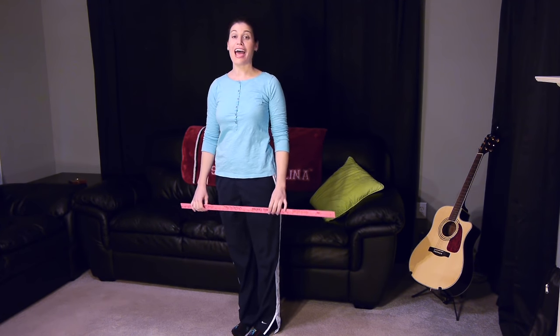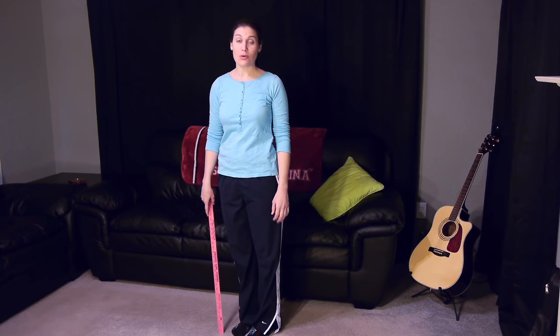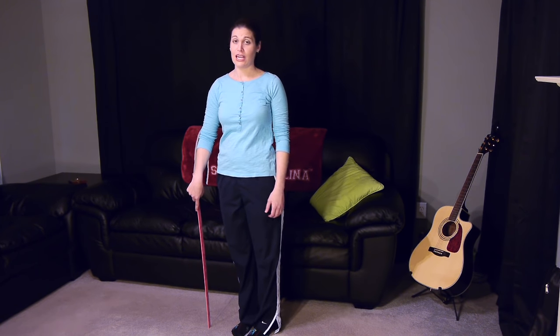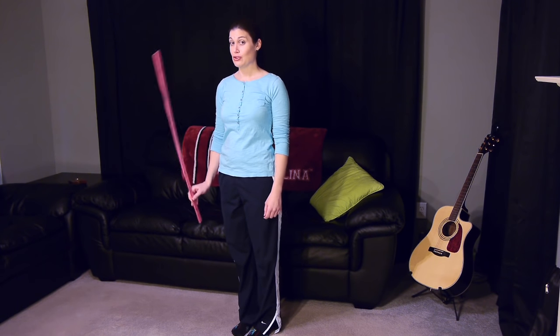Hey everybody, it's Dr. Jo, and today I'm going to talk to you about how to use a cane properly. You would think that such a simple thing wouldn't be that hard to do, but even people on TV like Dr. House and Rumpelstiltskin don't use their canes right. I always tell my patients, you don't want to fix one thing and then have something else hurting because you're not doing it right. So let's get going — I'm going to show you some real simple steps on how to use your cane properly.